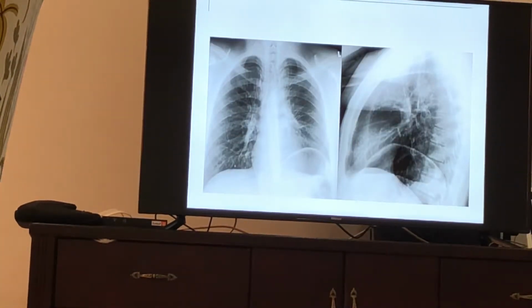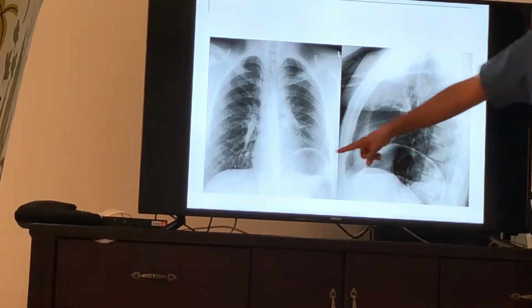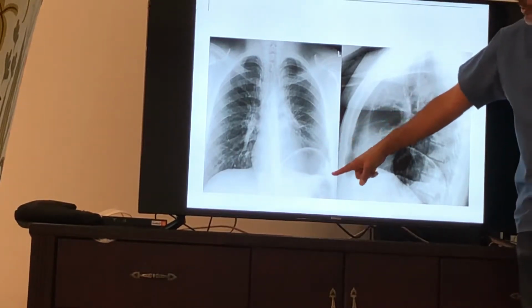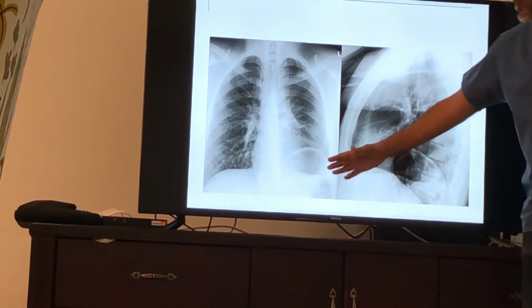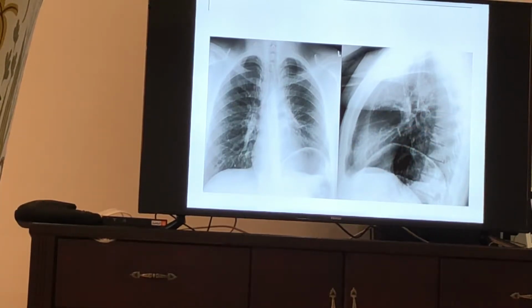Okay. What about this one? Elevated left. So start focusing. It's most likely not the same pathology, but what he realized is that there's an elevation, and in the lateral view it's very clear that there's a double diaphragmatic border, and this is a diaphragm. This is what the diaphragm looks like. This is how thick it can be. What we have here is left eventration or left elevated hemidiaphragm for differential diagnosis.